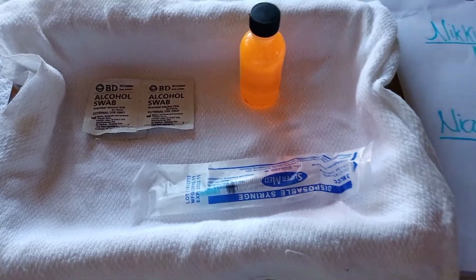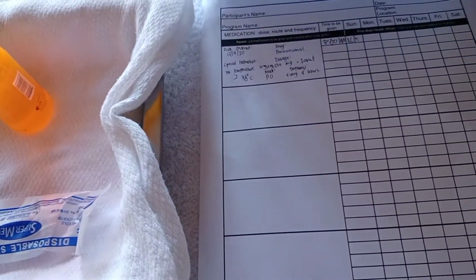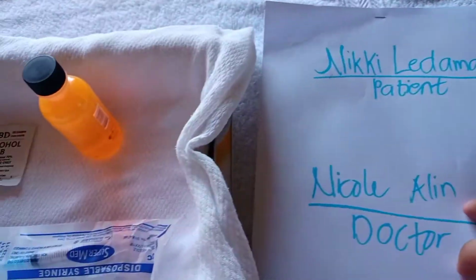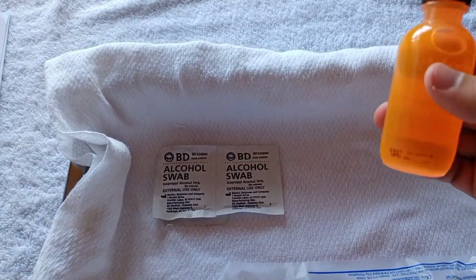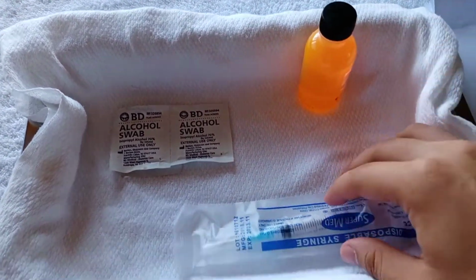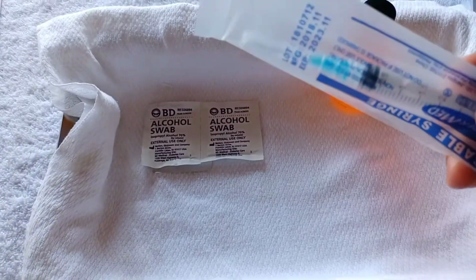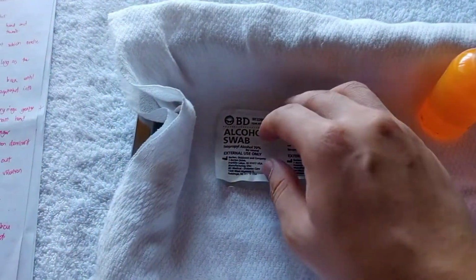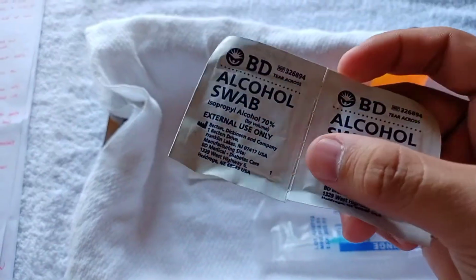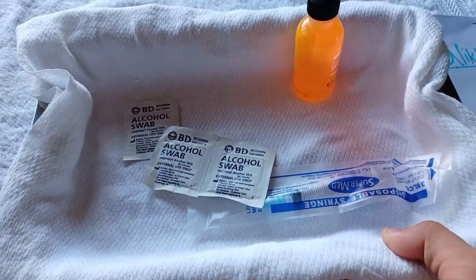Prepare the materials needed: your medication administration record and your vial. This is your vial. Then an appropriate syringe for injection, considering the viscosity of the solution, an extra needle, an alcohol swab, and lastly your medication tray.